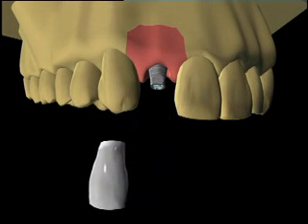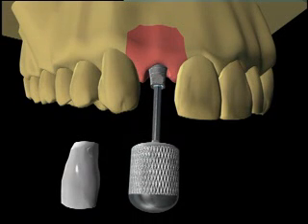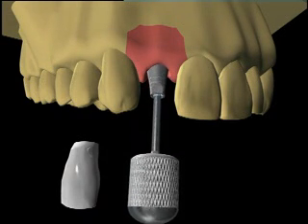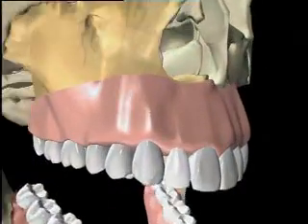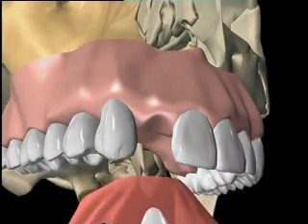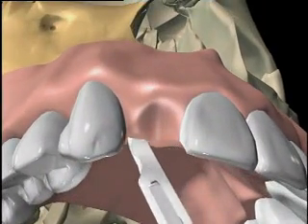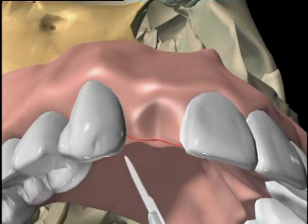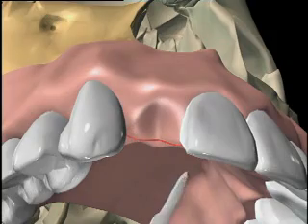Patient selection and preoperative preparations are all essential components that yield the benefits of the SmartSteps immediate provisional restoration technique. Patient acceptance of implant dentistry may be hindered by the time that elapses from implant placement to restoration. SmartSteps immediate provisional restoration technique, demonstrated here, provides the patient with an aesthetic result on the day of surgery.